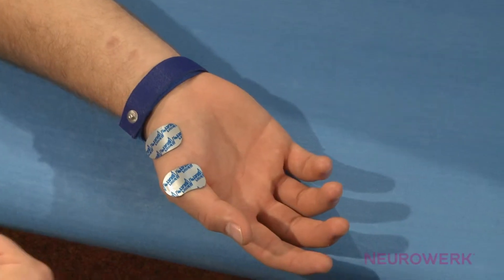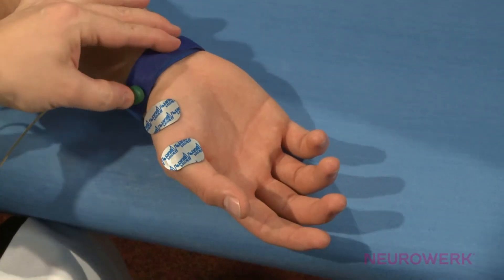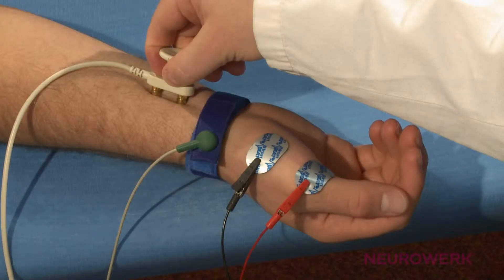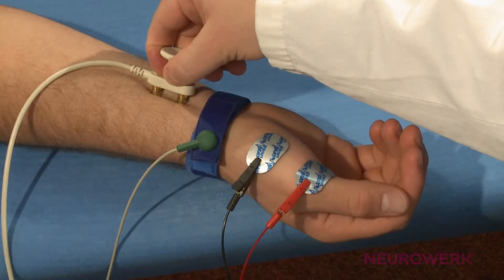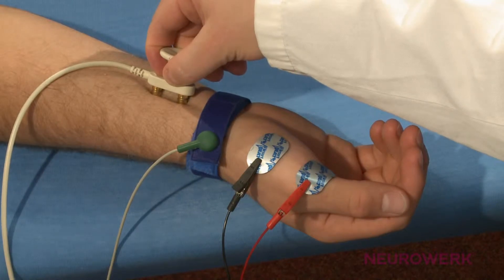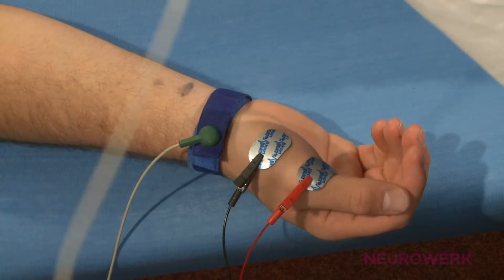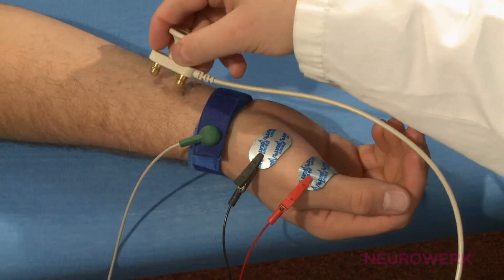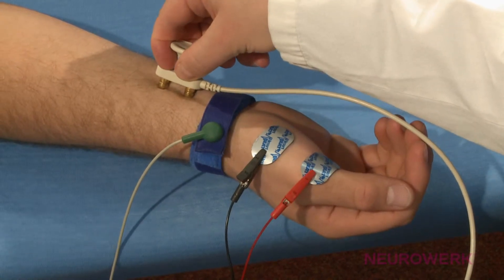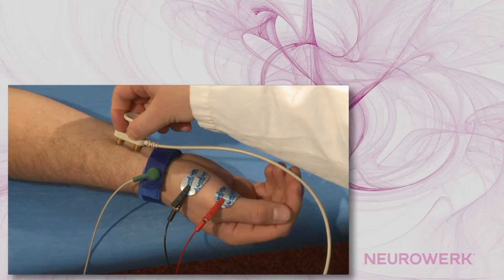The grounding strap is fixed at the wrist between the stimulation and recording electrode. In contrast to the motor neurography, the stimulation electrode is placed on the wrist above the median nerve. This ensures that the cathode, which is the minus electrode, points to proximal.